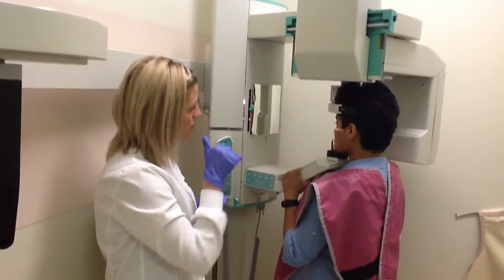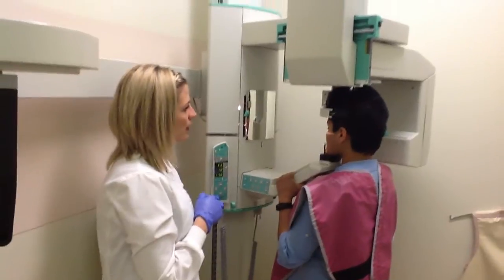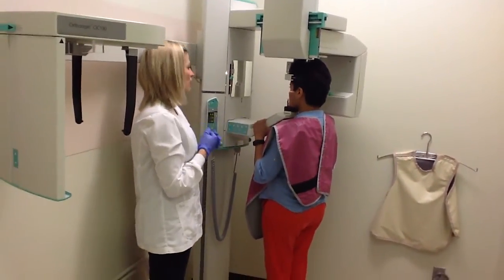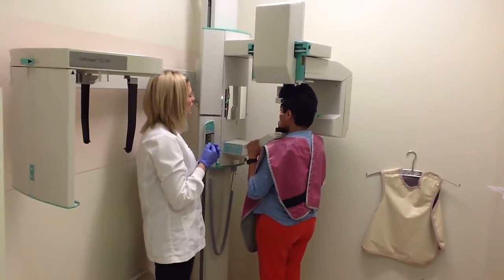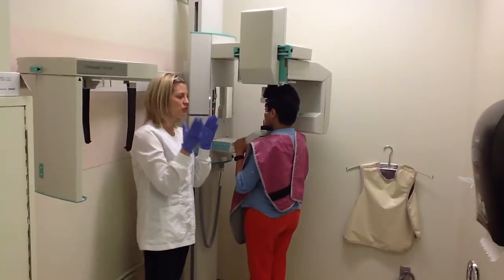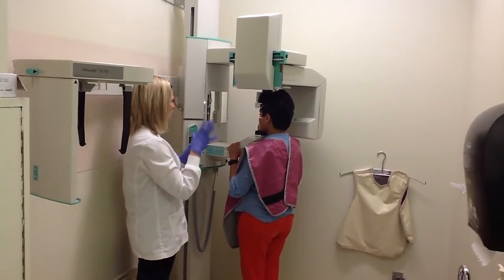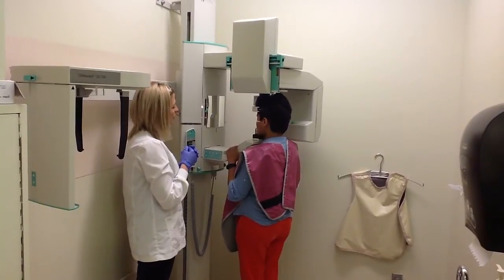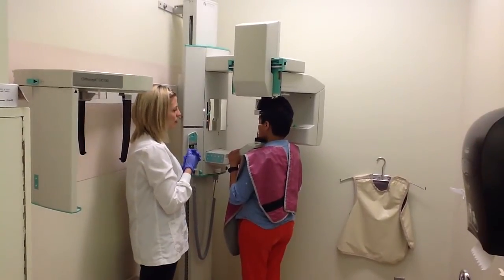So now I'm going to ask the patient to close her lips around this bite block, swallow, and raise your tongue to the roof of your mouth and hold it there. The machine is going to rotate around you. It takes about 30 to 40 seconds. You may want to close your eyes because people have a tendency of following the machine, which would alter your positioning. So if you could close your eyes and just relax, just hold as still as possible. And you'll hear it'll take about 30 to 40 seconds.